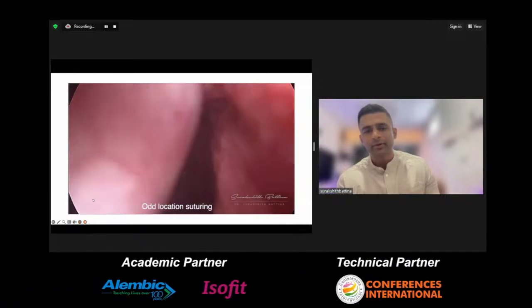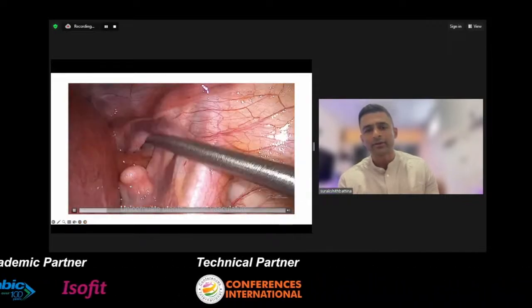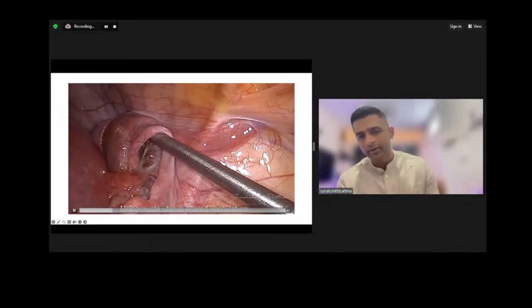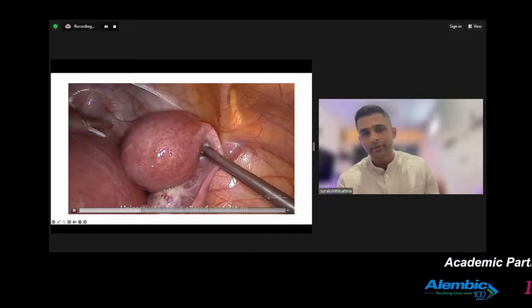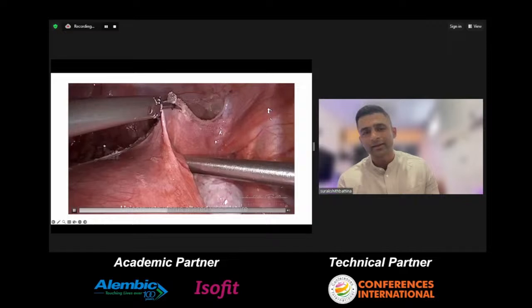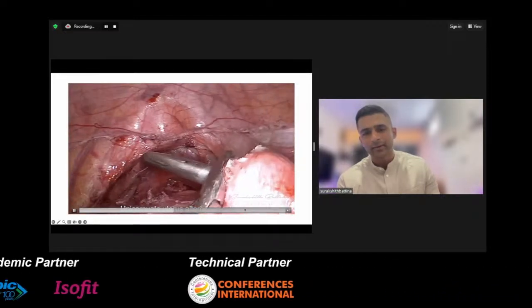Again, sometimes you will have patients who have unicornuate horns, so altered anatomy is also there for some patients. At that point you need to know where the uterine artery is, and then take the stitch accordingly. As you can see over here, for this patient the uterine vasculature is completely changed, so you have to skeletonize the whole peritoneum, and then plan the stitch.